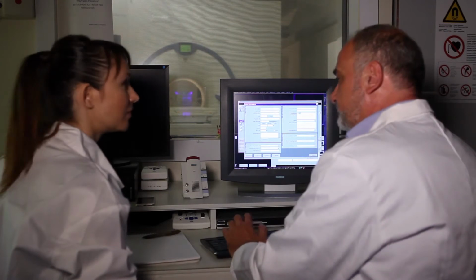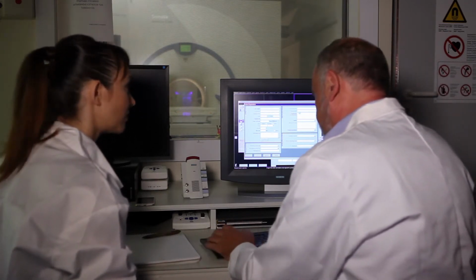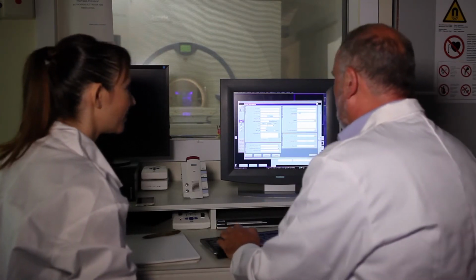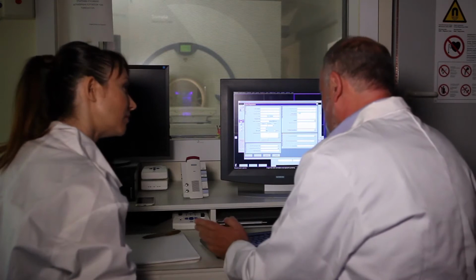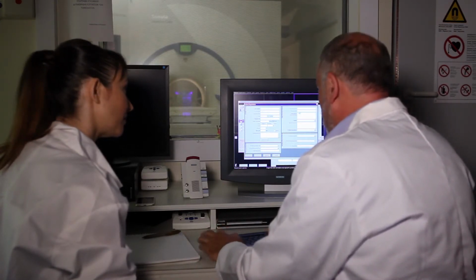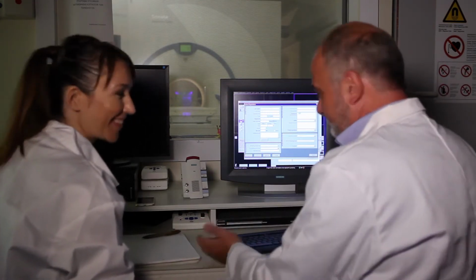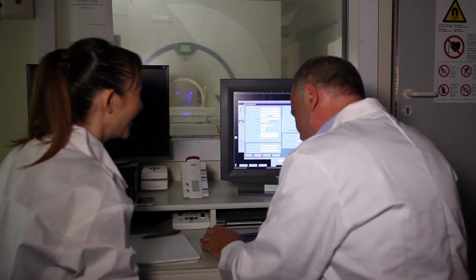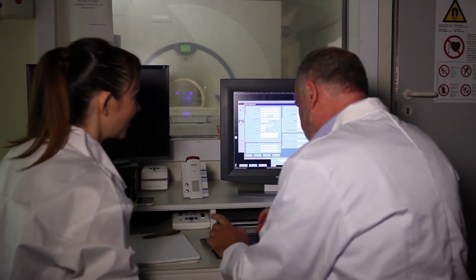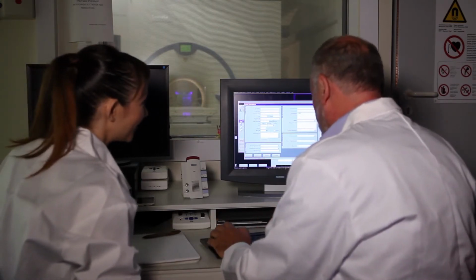We need to give the first name for the DICOM, so the first name is going to be something like test, it's a normal name. And the ID has to do with the thing we're doing now, so it's QA MR, let's say 001, or test. Date of birth, even my birth date, so it's there. So we give my birth date. So we cannot continue without a date of birth? That's sure. Reverse again.